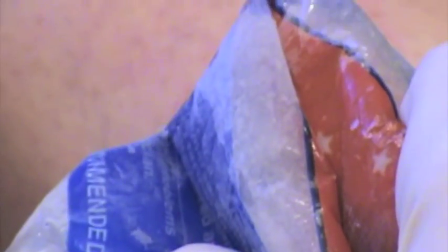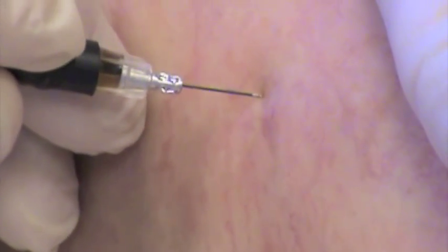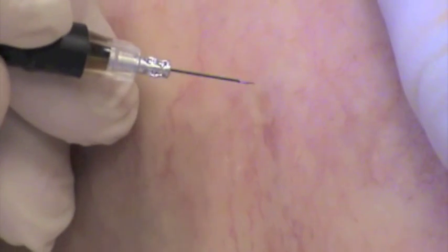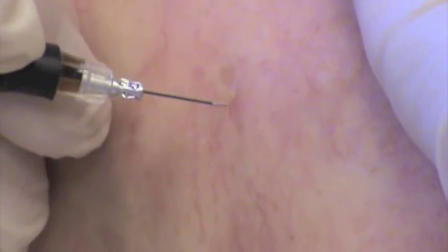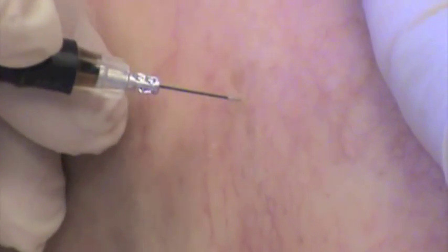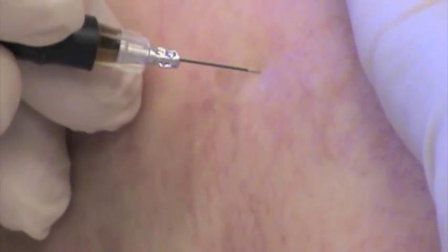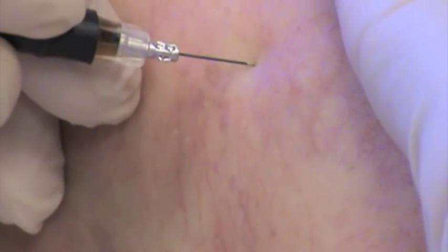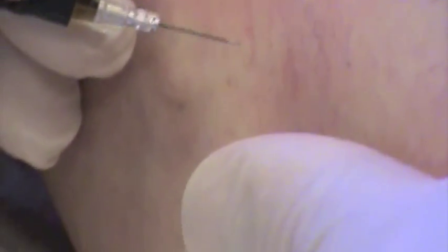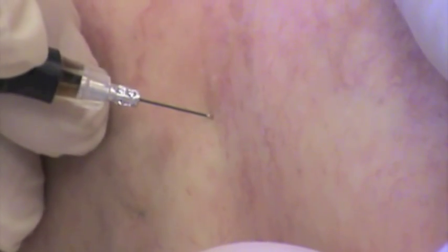This cools down the skin a little bit more. Stretch the skin a little bit to see the veins nicely. The whole needle is not inserted in this case — you don't need to, it's not that deep. If you have a vein that doesn't clear, you can leave the needle in there to let it fire a little bit longer.